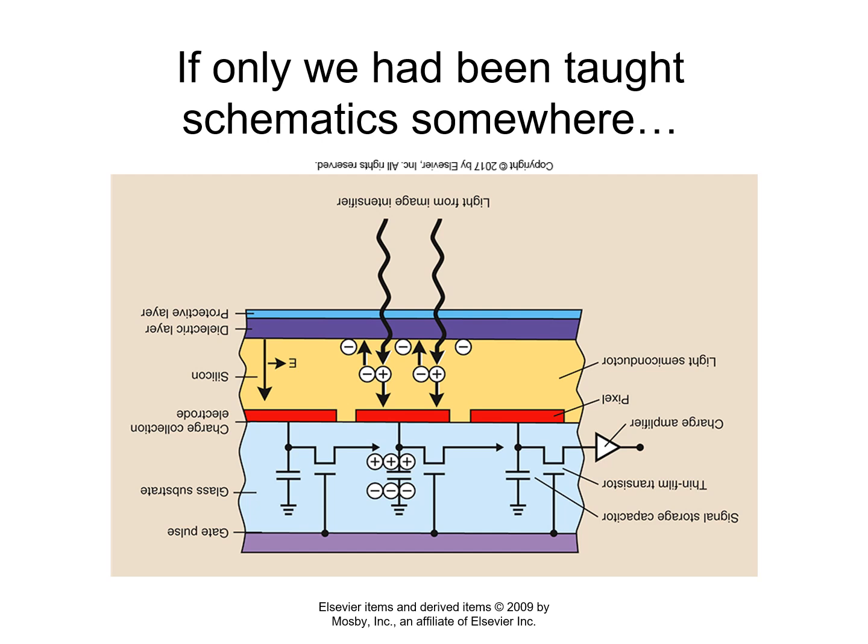Okay? And so the charge amplifier, basically it's boosting the current. Okay? So it functions very similar to a step-down transformer. Okay? So a bolus of charge comes in, the charge amplifier amplifies the current, right? And then that's sent to an ADC right off of the charge amplifier. So how do we get the third row of pixels to get to the charge?